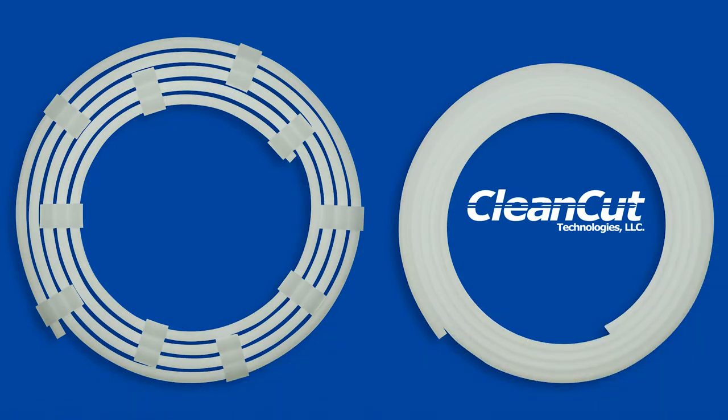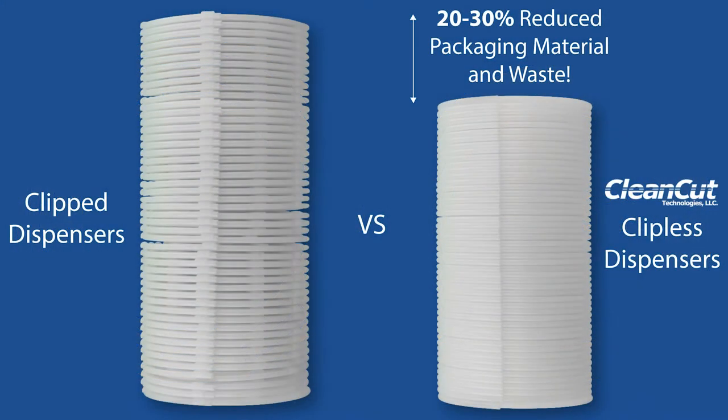The result is an innovative one-piece sturdy design that reduces additional packaging material, weight, space, and excessive waste by 20 to 30 percent when compared to clip dispensers.